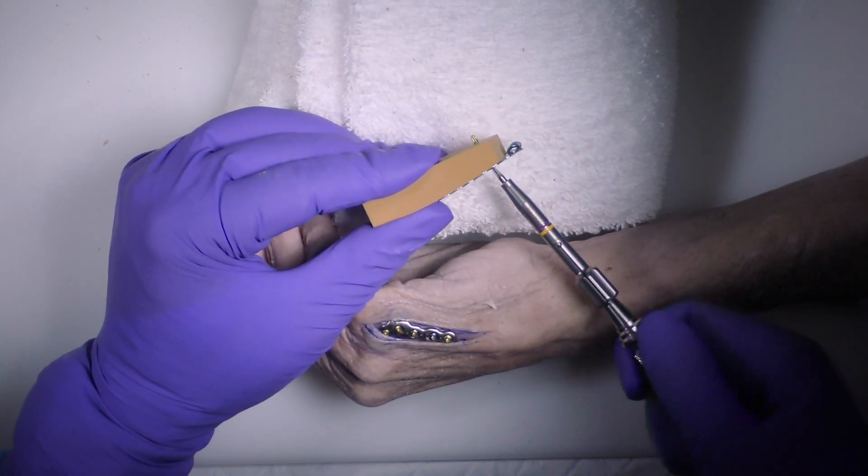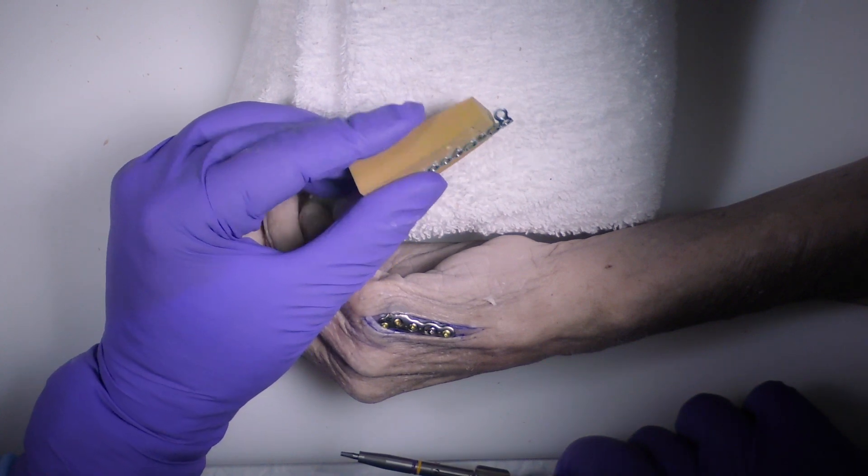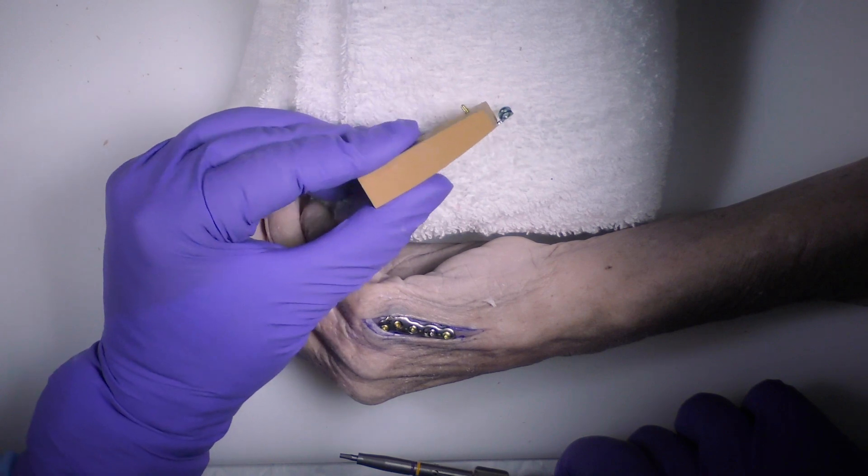Then advance this, and we achieve both compression of the plate to the bone, or vice versa, and locking of the screw to the plate.